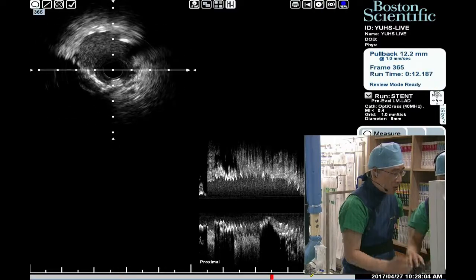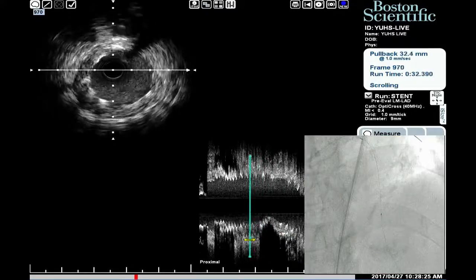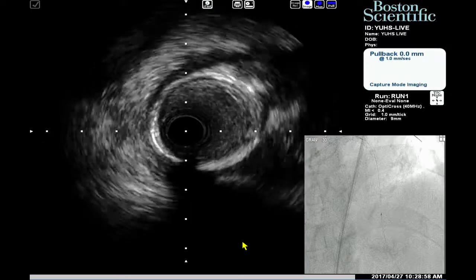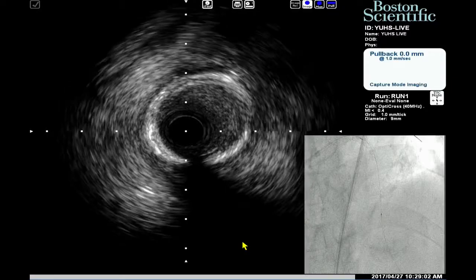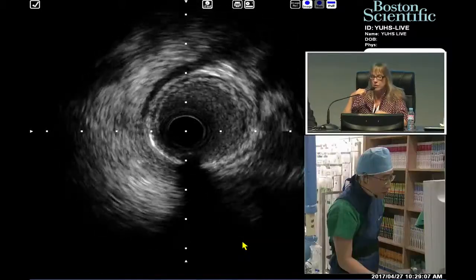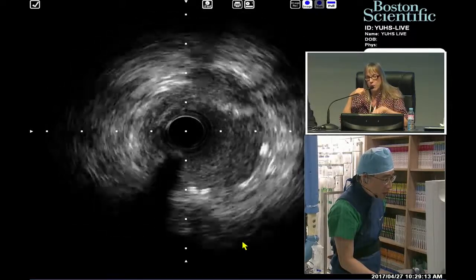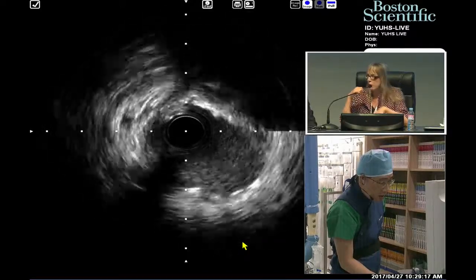Maybe we can discuss stent expansion. Who wants to say something about that? Okay, once again, IVUS again. I think distally we see that we have nice stent expansion, no distal edge dissection, which is important. If we go further proximally, we saw already on IVUS that the ostium of the circumflex is wide open, which is very reassuring. And now the discussion is whether or not the left main stent is well expanded or would benefit from additional post-dilatation.